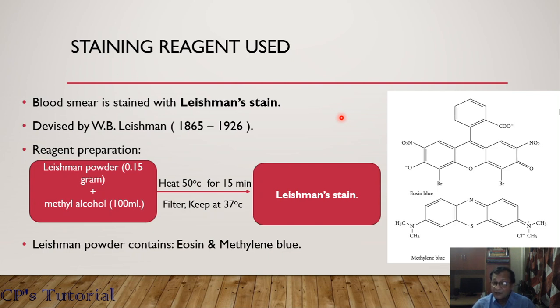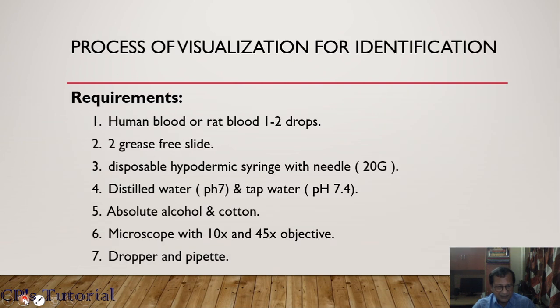So methyl alcohol should be acetone free. Now the staining material is ready for the reaction.